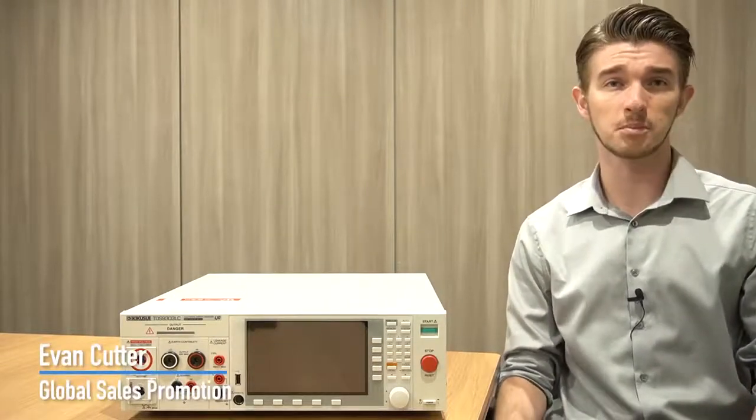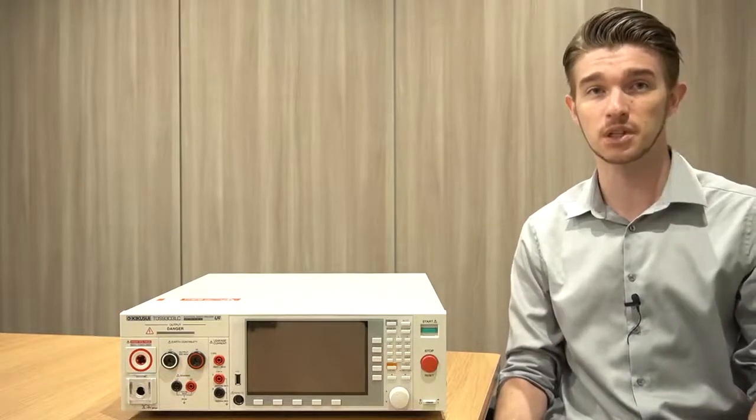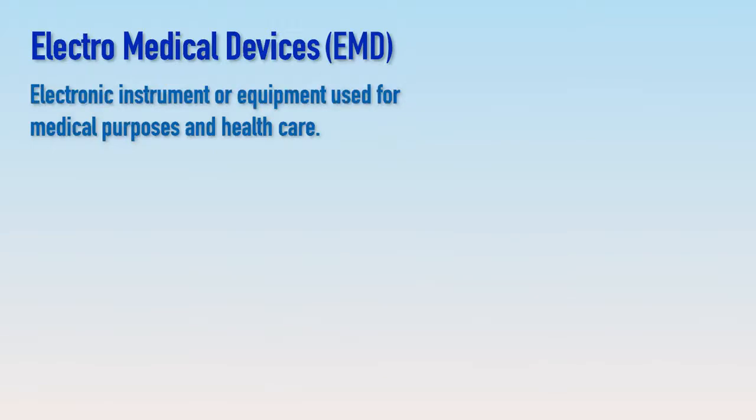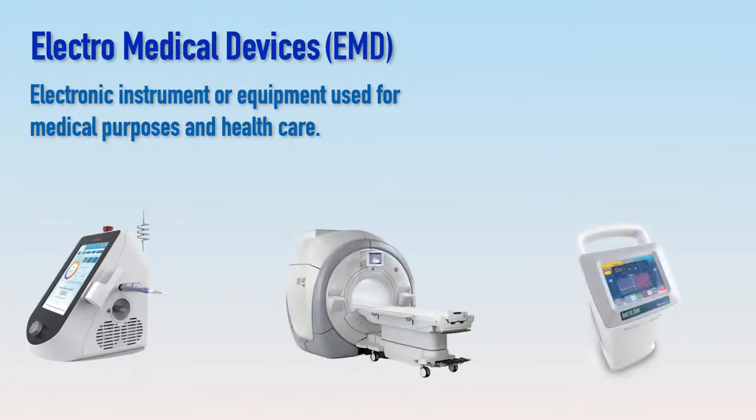Today I'm here to discuss patient leakage current testing, an extremely important electrical safety procedure required for electromedical devices. Electromedical devices, or EMDs, envelop a wide range of instruments used for therapeutic or diagnostic purposes. These include anything from surgical instruments and catheters to imaging equipment and monitoring devices.